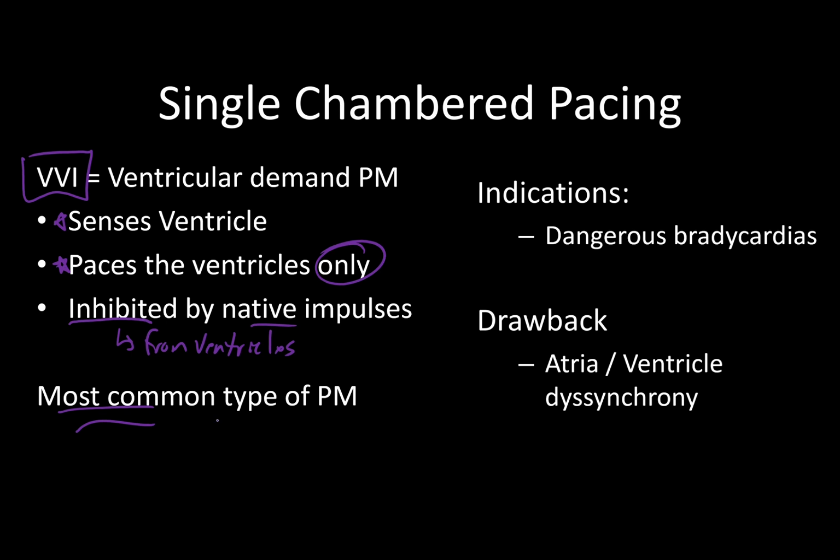And this is very common. It's essentially always used in temporary pacing, unless you're in a really high-end institution. And for someone who just needs some assistance from the pacemaker, you're permanent as well. And so that very first graphic I showed you of the different types, VVI is what a very simple permanent pacemaker would look like, or at least the function that it may serve.